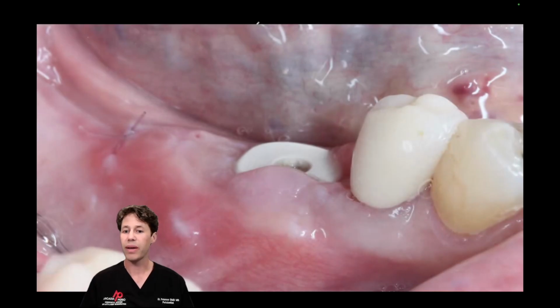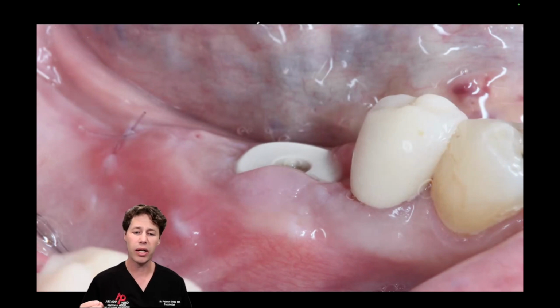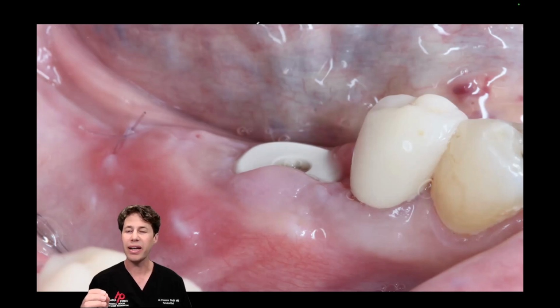So here we are at 2 weeks. Wonderful healing. That tissue is going to continue to shrink and remodel. We're at a nice depth. We're going to get good emergence. We're going to let this area heal for about 5 months or so. Even though insertion torque was 35 plus Newton centimeters, I tend to let these areas sit for a little bit longer. That's a personal preference.